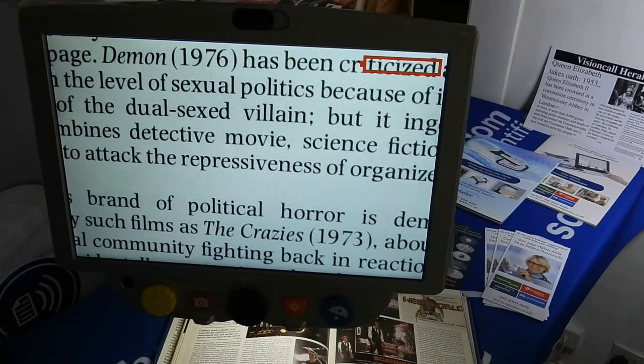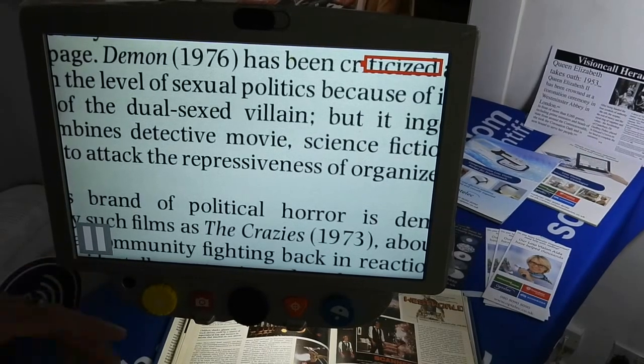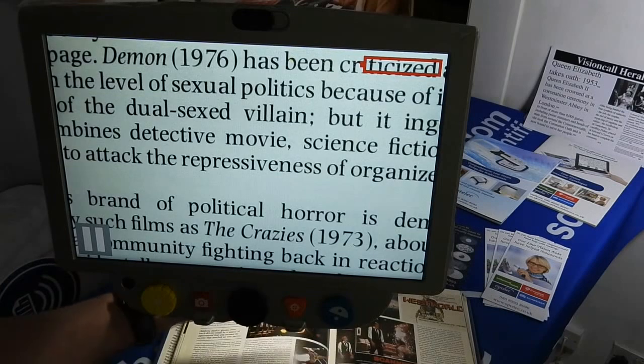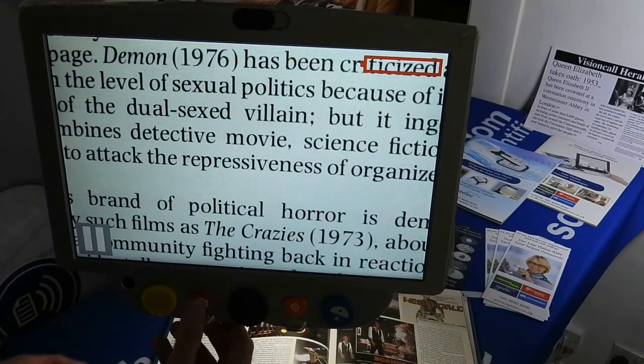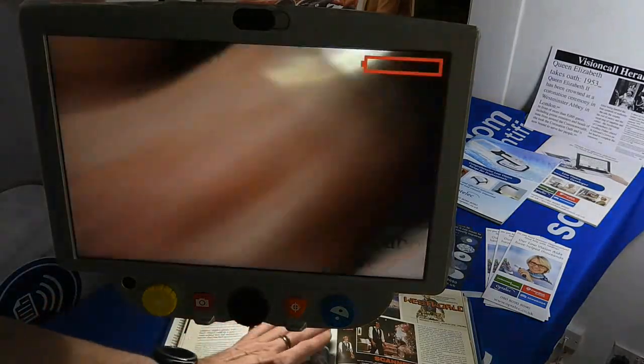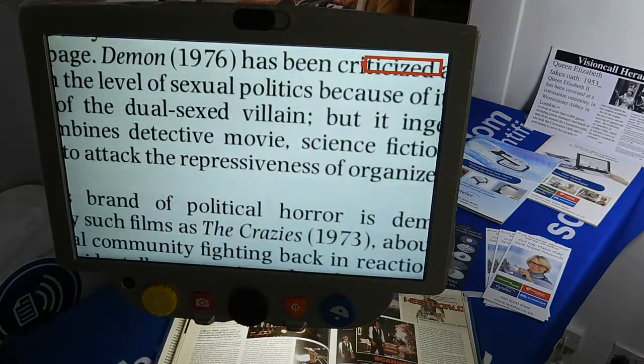Because it is a camera system, you can freeze the image and also save photographs. By pressing the camera icon, the pause button appears and the image is actually frozen — if I put my hand underneath there's no movement. Press it again and it unfreezes, back to a live image.